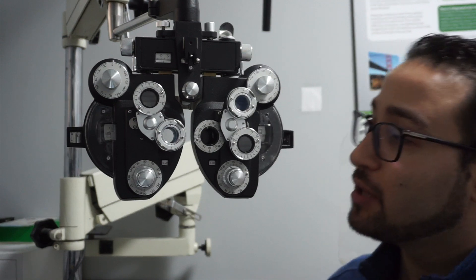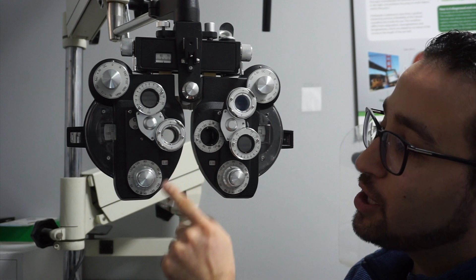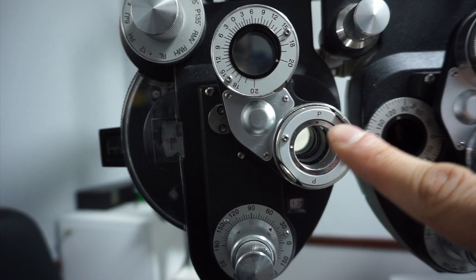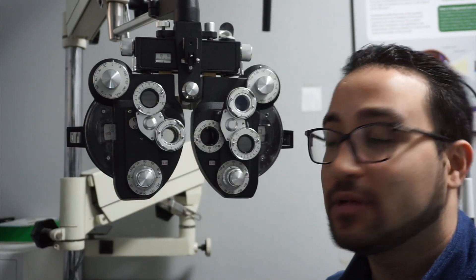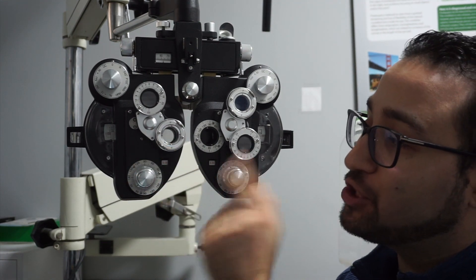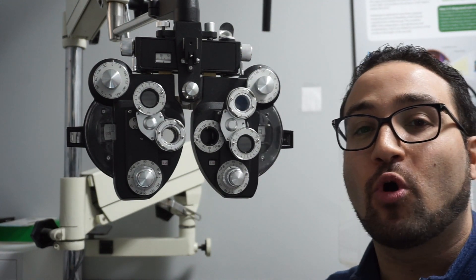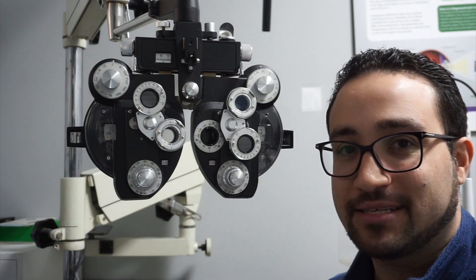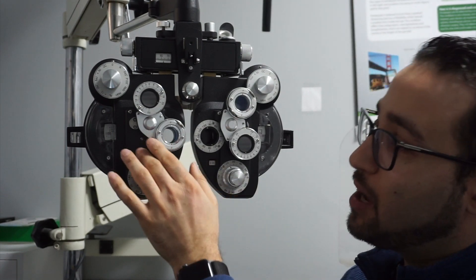This portion right here is called the JCC, or Jackson cross cylinder. The way we use it is to initially align these wheels to the axis of the prescription using the little arrows on the phoropter. This allows you to refine the axis of the patient's astigmatism. We ask: is option one or option two better? The patient mainly focuses on the 20/30 line or the line with more O's and C's to tell the difference based on the axis.